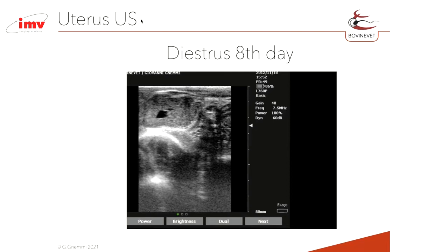This means that the cows are coming in heat, and on the day of the estrus, they have less than 0.7, 0.8 nanograms of progesterone per milliliter. But day 8 is also the best moment to start Ovsynch, because we remember that if you want to work with Ovsynch, it's important to work with 7 days of Ovsynch. It's important to work with 2 follicular wave cows in the presence of a corpus luteum, but with the dominant follicle active, better if it is 15, 16 millimeters.